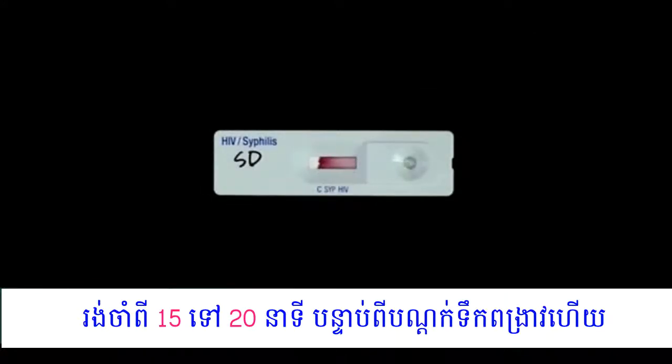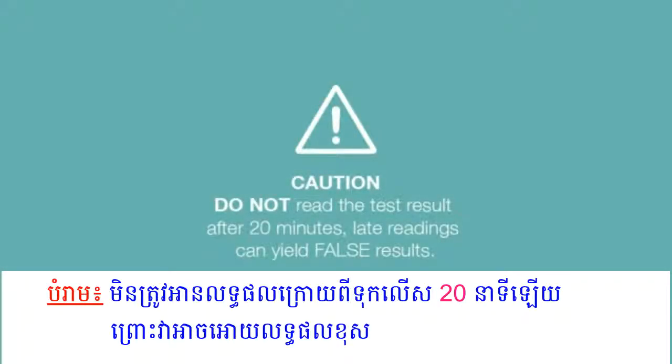Read the result after 15 minutes for clear interpretation, then read the result at 20 minutes. Do not read the test result after 20 minutes, as reading too late can give false results.